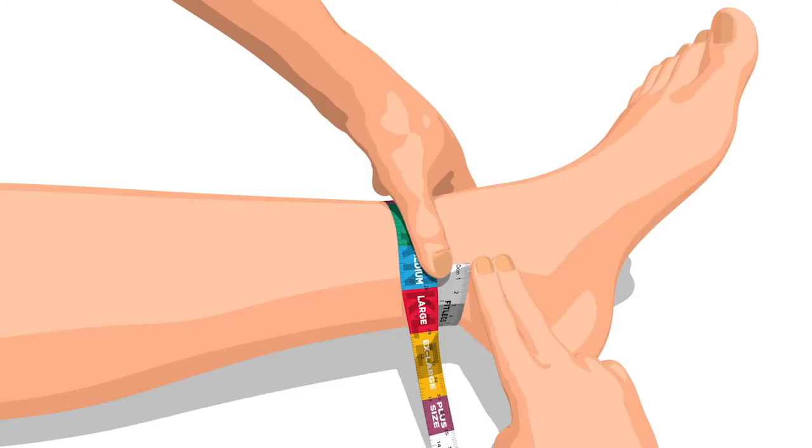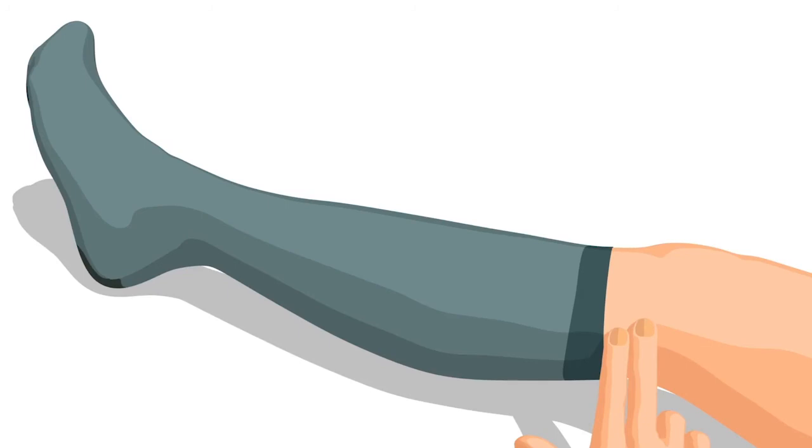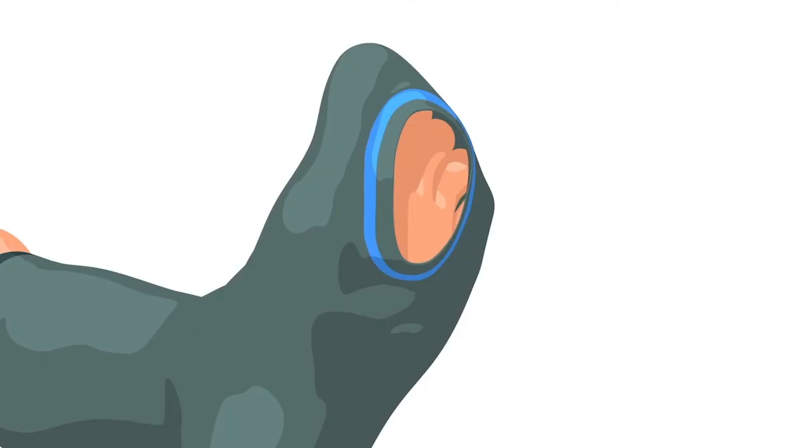To summarize, take one measurement 2 finger widths above the ankle. Ensure the heel marker is positioned correctly. The stocking should sit 2 finger widths below the crease at the back of the knee. Avoid creases and ensure the toes are covered.